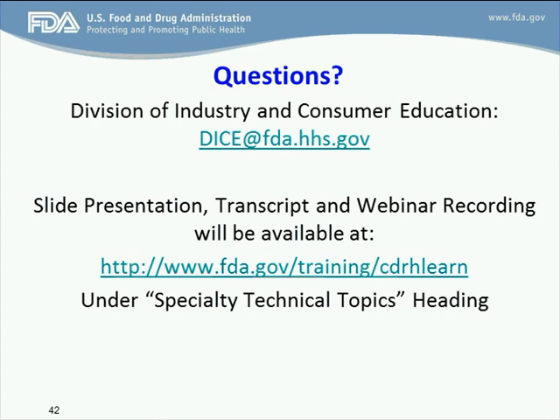Thank you. Our next question comes from Michelle Alpha. Your line is open. Thank you, and I just wanted to commend the group. It was a great presentation and helped clarify a lot of things. You mentioned under the cleaning validation section that worst case conditions should be mimicked during the validation process, and you also indicated the use of 2 quantitative test methods.